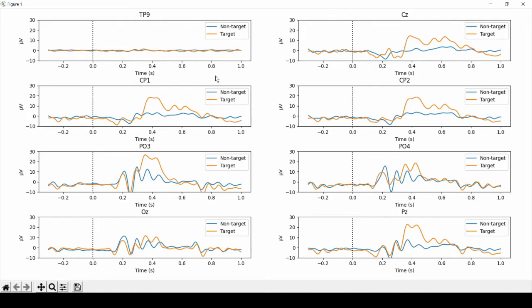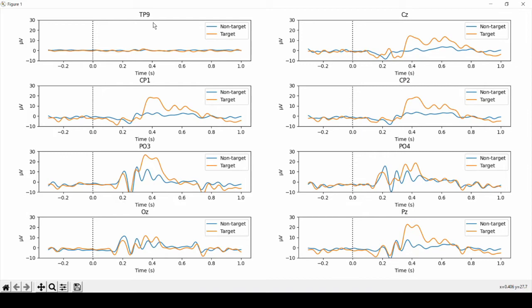Starting with TP9, no difference in the signal is to be expected here, not only because of the temporal position of the electrode, but also because the analysis script re-references the signal to both mastoids. So not only TP10, where we had placed the unipolar reference, but also to TP9, so the average of both. And that's why you get the flat lines here, as expected.